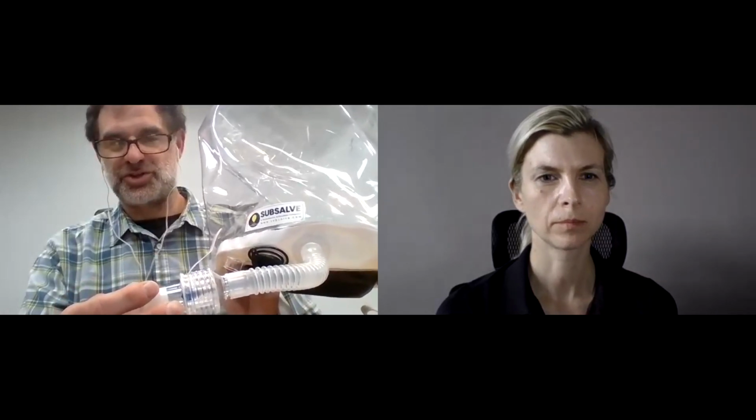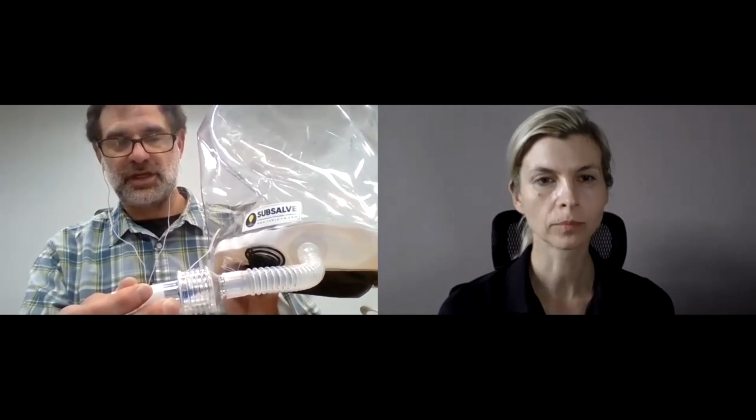It opens at very, very low pressure, 2 centimeters of water, I believe. It's just a spring against a disc with a little silicone seal. Very simple part. Things that could be tested down the road: would you want this very close to the hood? Could it be, in this instance, a 100 cc hose length away from the hood? Is it better to be on the inhale side or the exhale side? Maybe you could configure it to be on both. But it's an important part that we discovered and may be able to be repurposed for helmet ventilation.